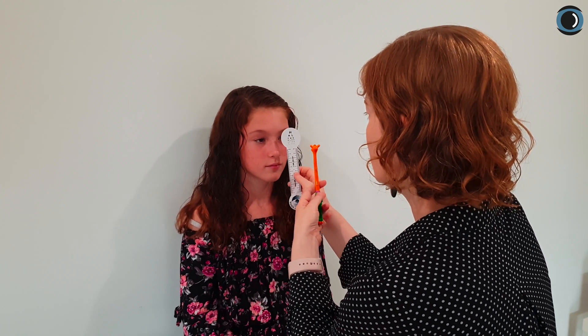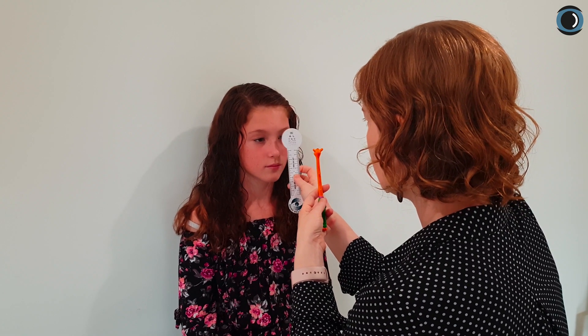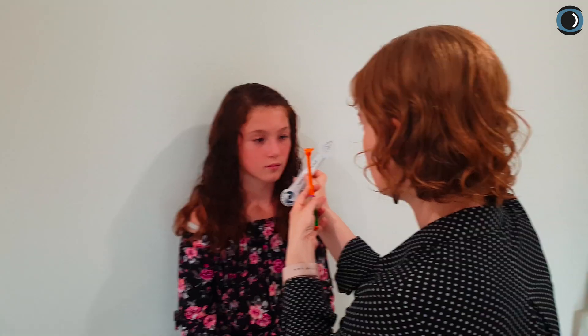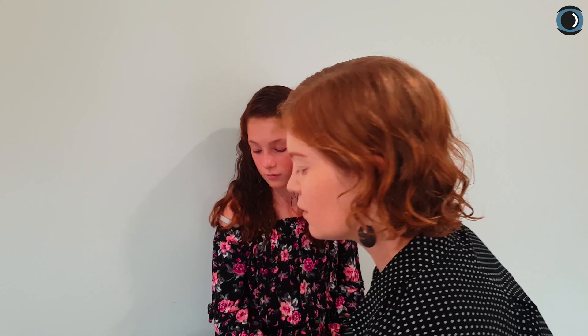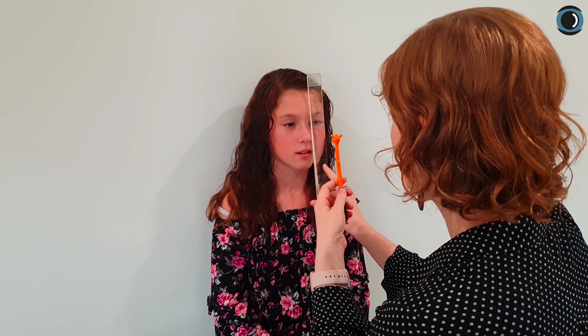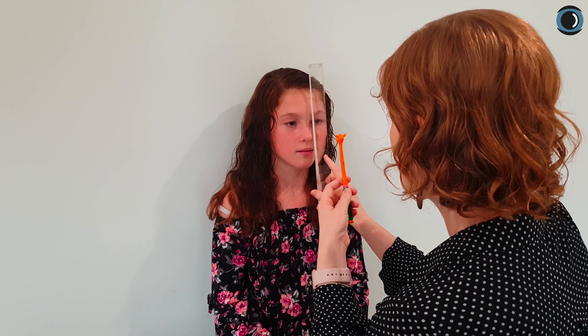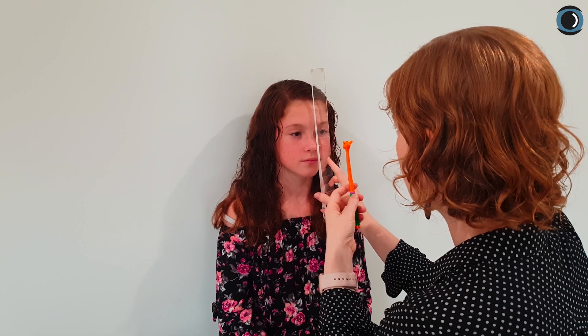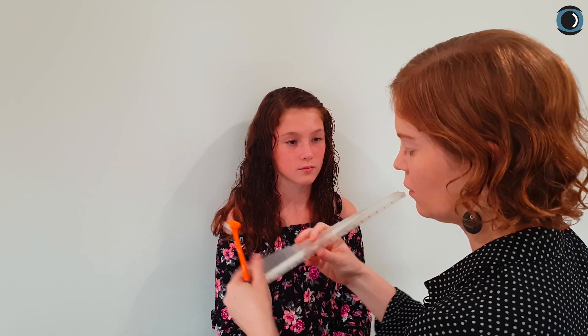Now if we have a look at her cover test after doing the fusion reserves measurement, we can look for any fatigue — particularly if there's an issue with dropping into an eso after converging. We can see she's got a tiny little exo there and very good recovery. Let's have a look at her divergence once more to check for fatigue effects. Her eyes are very steady, she's holding without diplopia, recovery is good, and she got 12 out of 12 again.